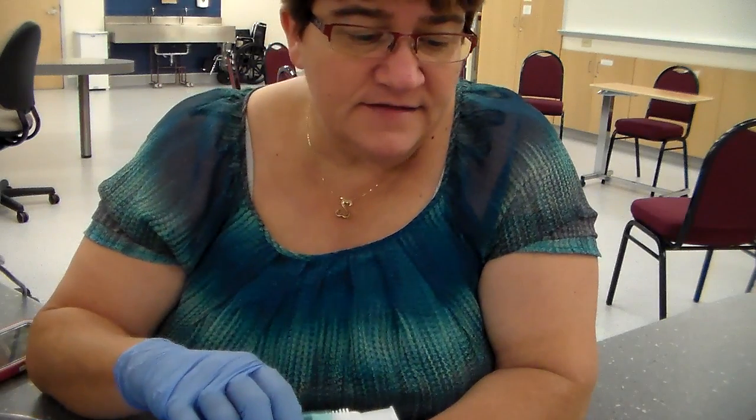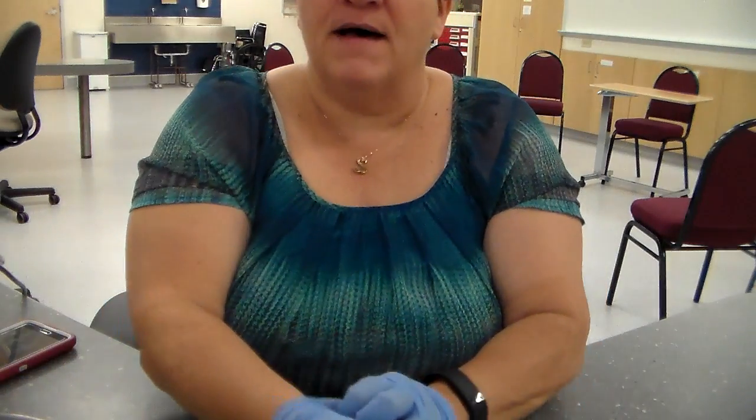So that is skill 2.32, administering medication by a nebulizer.